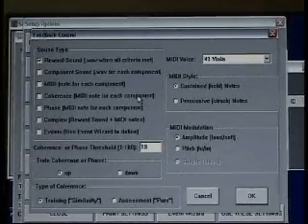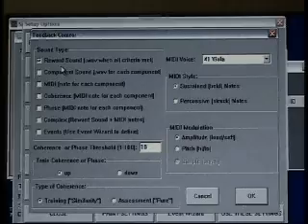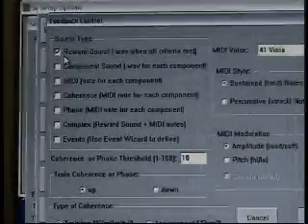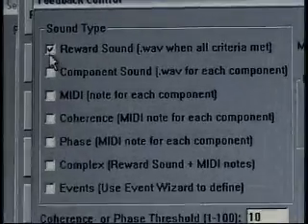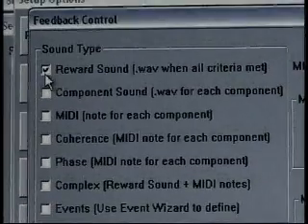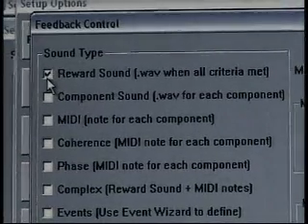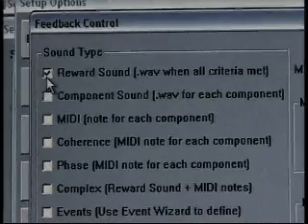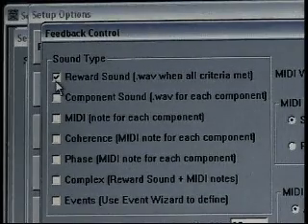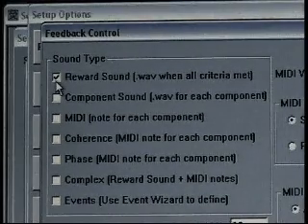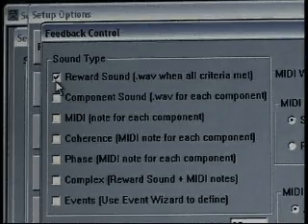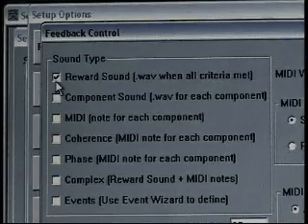Starting at the very basics, zooming in to reward sound — that's the default. This is your simple beeps, clicks, bells, dings, your simple one-tone type sounds. We notice the definition that it is a dot wave file when all criteria is met.